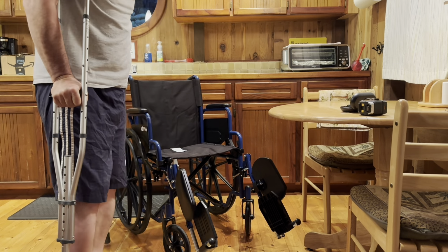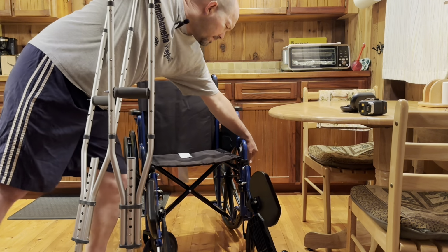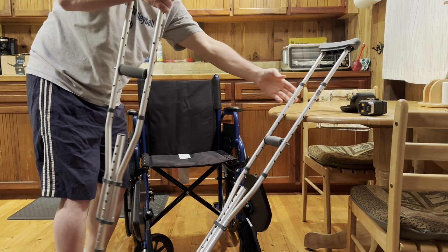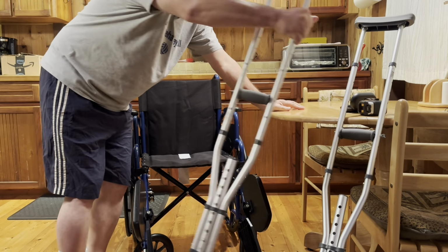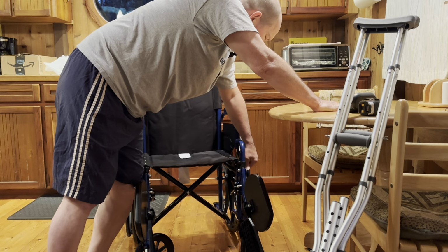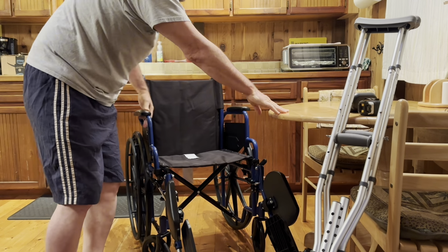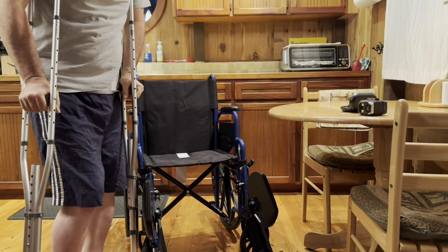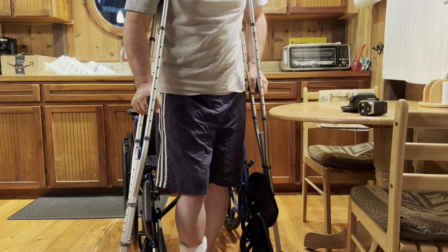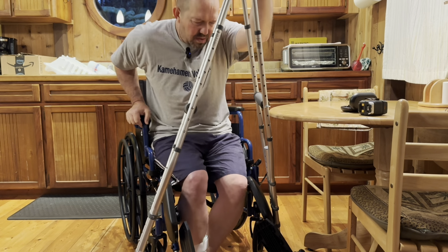Before getting into the wheelchair, you want to lock. Oh gosh, that actually is one of my complaints. One of my complaints is that the wheel locks are not properly adjusted, and they are extremely tight. I'm actually going to adjust that. I just needed a wheelchair for the time being until my tibia can heal up. So it's good to lock that in place so the chair doesn't roll away.